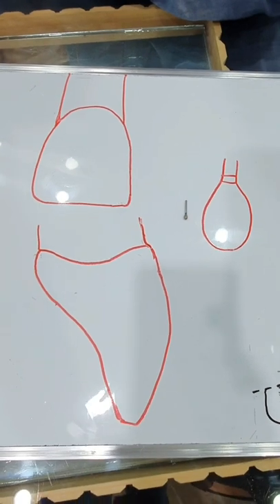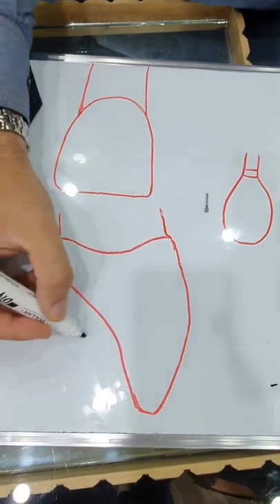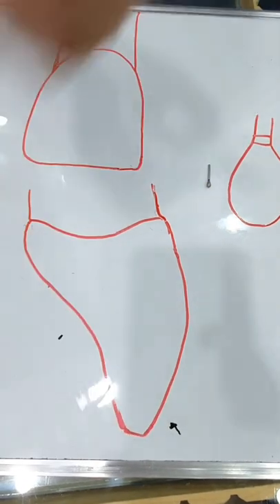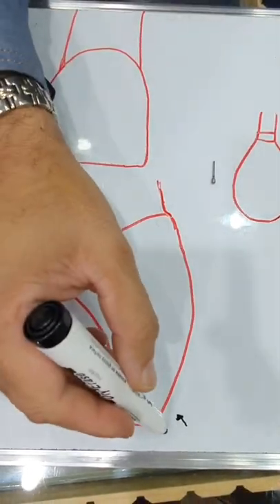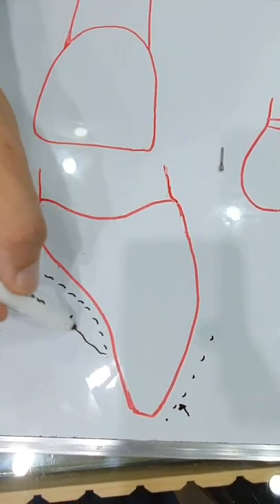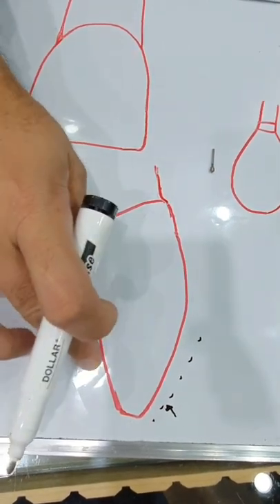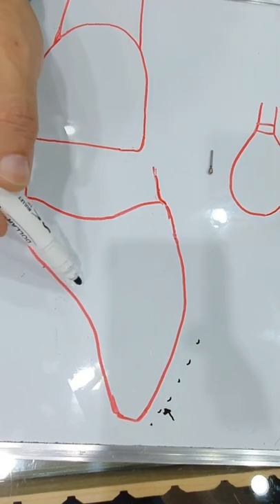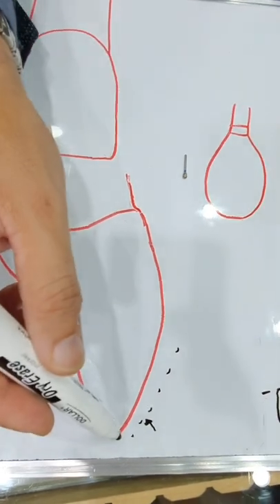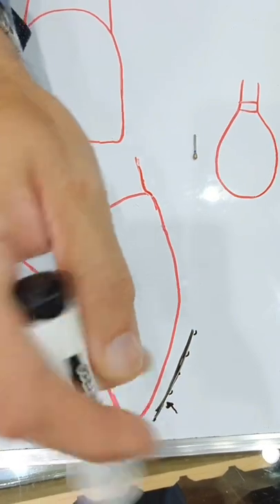It could be upper or lower. Of course, if it was an upper tooth, then the functional surface would be on the palatal side. And if it was a lower tooth, the functional area would be the incisal-facial aspect. So this would be the functional area. And generally on this upper tooth, the maxilla, this would be the functional area, because that's where the lower tooth would come in and interact with the upper one. And that is where you would need to have the thickness of the metal or the contacts. And in the lower tooth, depending on the overbite, normally the incisal edge and the incisal facial half or third is the functional area.